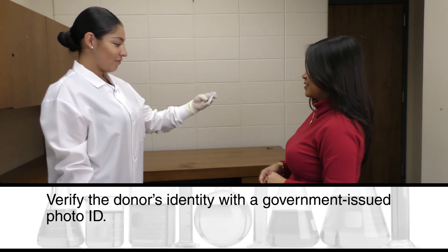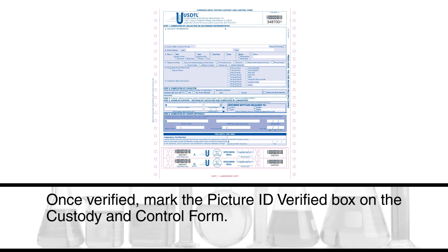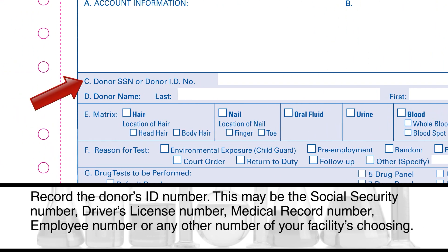Verify the donor's identity with a government issued photo ID. On the custody and control form, do the following: once verified, mark the picture ID verified box. Record the donor's ID number — this may be the social security number, driver's license number, medical record number, employee number, or any other number of your facility's choosing.